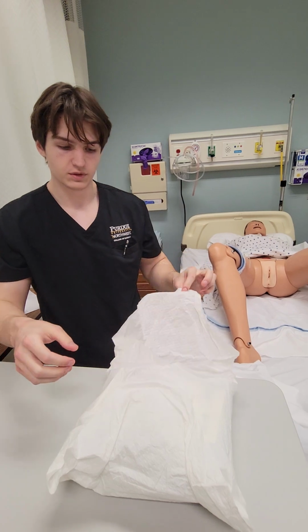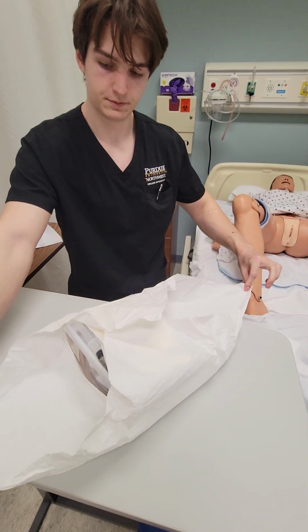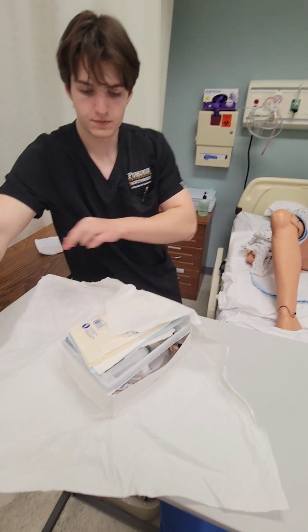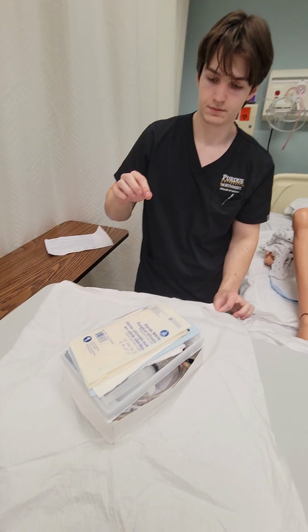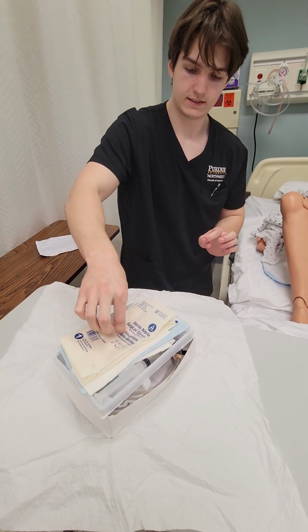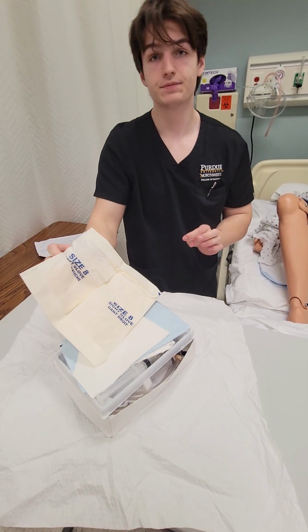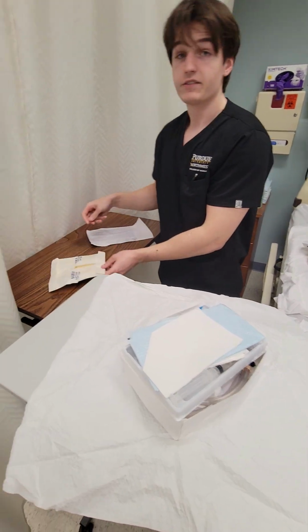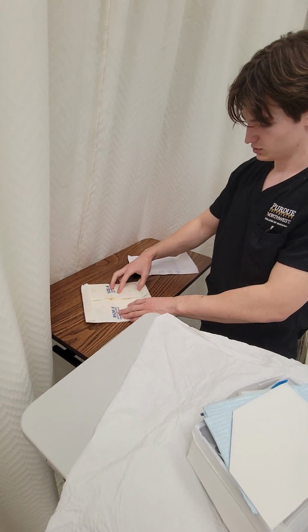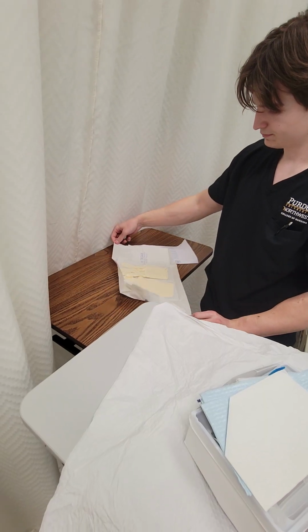So I'm going to start moving this one out the way, and I'll move this one out the way. I'll bring this one down, rotate it this way. Now we'll pick up this one. And start gloves. There you go. They are pre-opened and pre-used. Have to reuse materials for this. So now I'm just going to open my sterile glove kit.